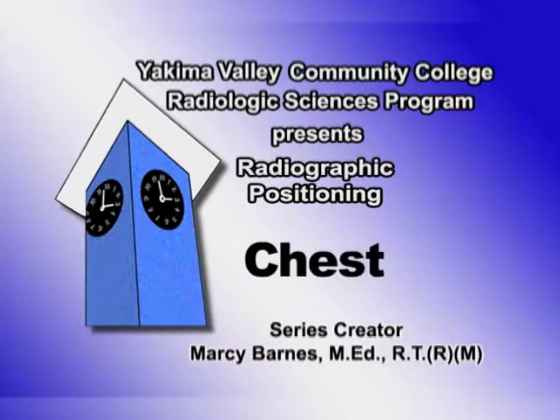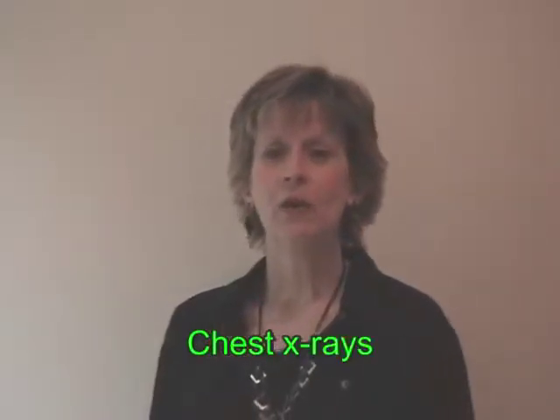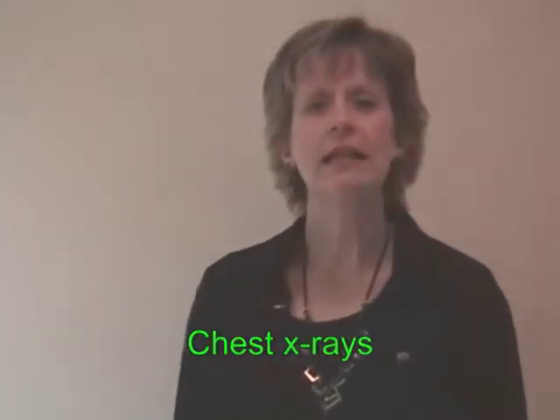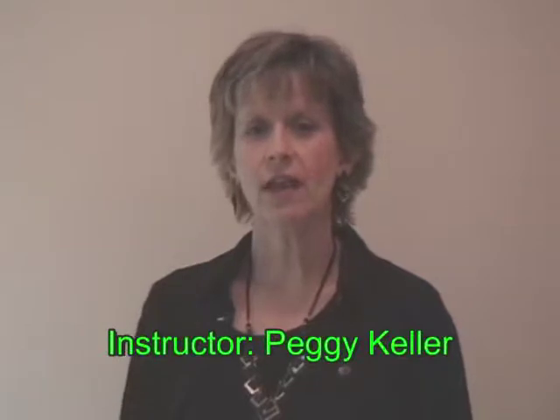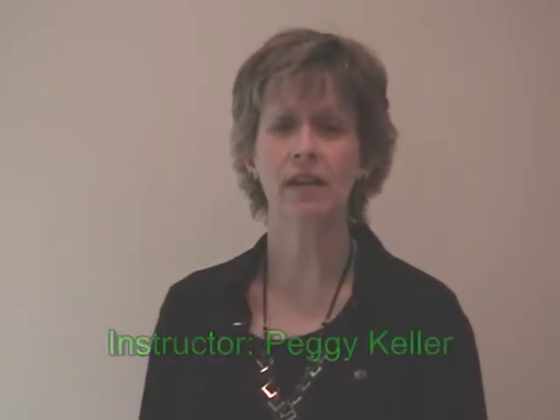Chest. Today's lesson will be on chest x-rays. We're going to discuss some patient needs before we actually begin the procedures. With chest x-rays, this is the beginning of your positioning career basically in the RT program. And there's some preliminary information that you will apply to all patients.